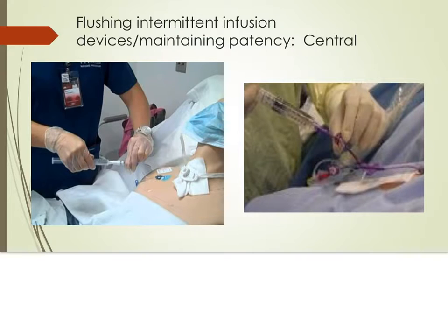The frequency of flushes for central lines may vary according to the device being used. Hickman, Broviac, and chest ports all have different requirements for additional flushes when the catheters are not being routinely used. Be sure to check your facility policy and the physician's orders.